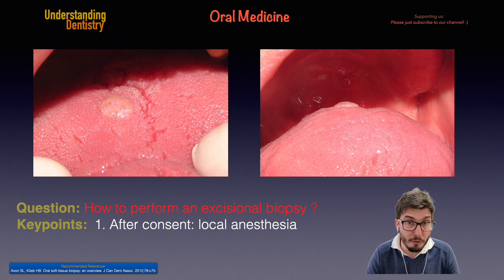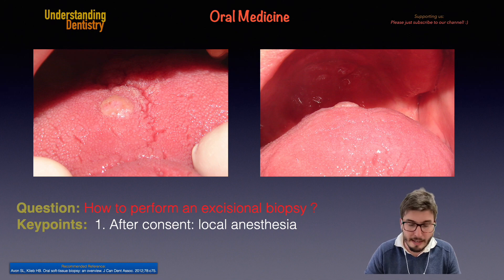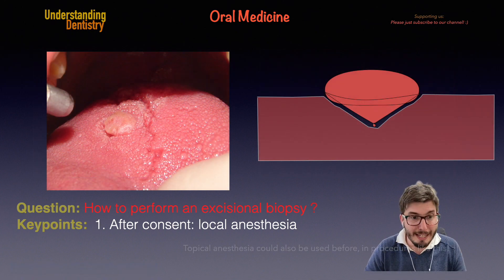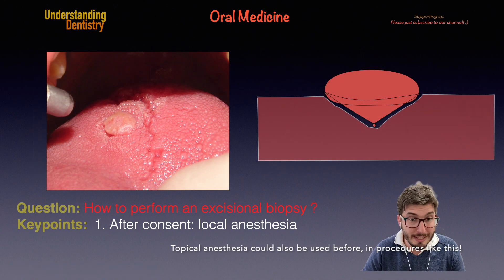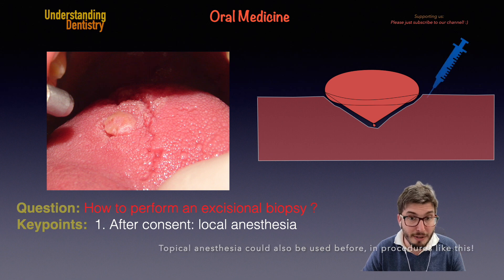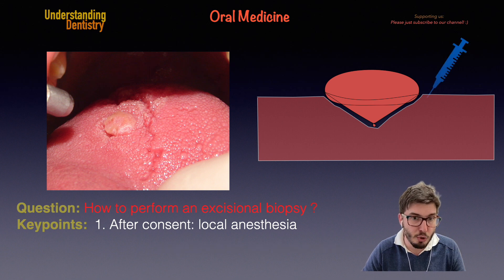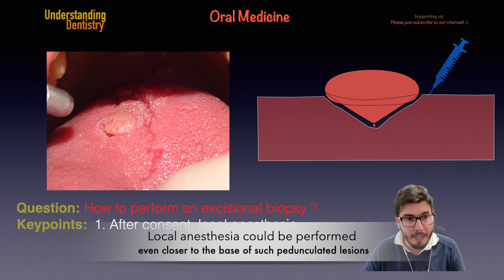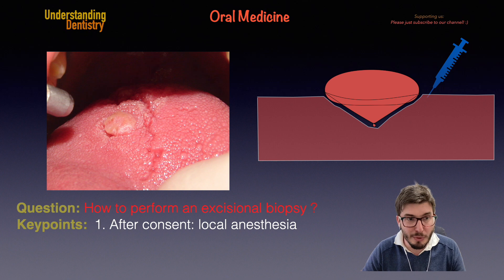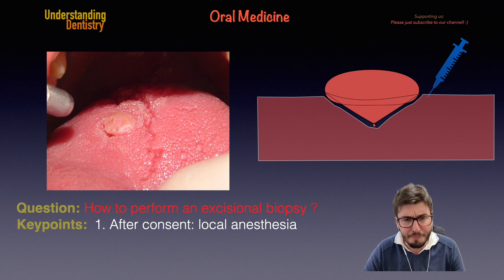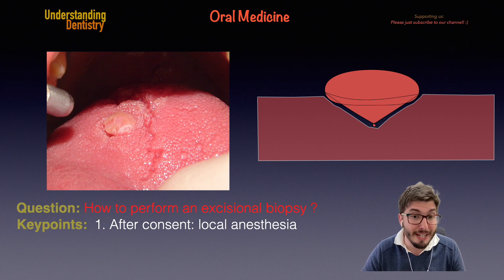After you get the consent of the patient, we can start with the local anesthesia. You want to perform the local anesthesia close to the base of the lesion. In the picture on the left side of your screen, we are blowing some air and now we can see that the lesion is actually pedunculated. We perform the anesthesia and then move to the next step.